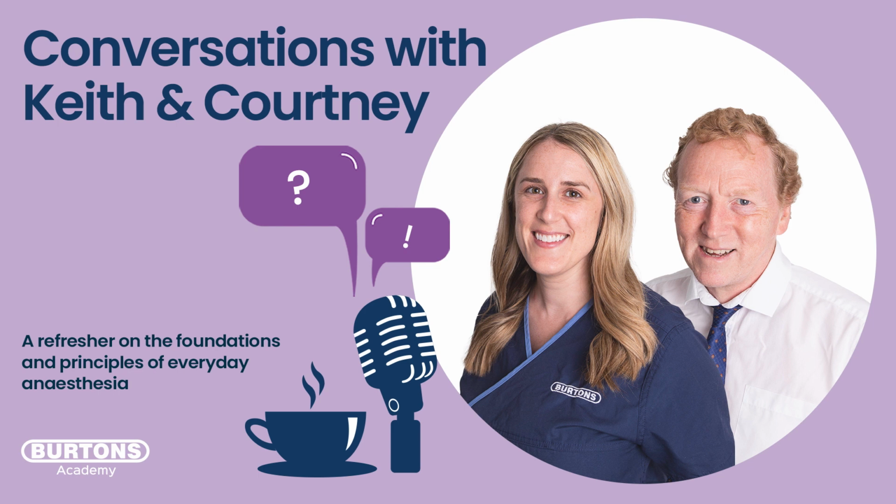So I'm going to go out on a little bit of a limb and put the figure of 10 out there, because I think 10 is a nice, easy number to remember. That 10 is 10 centimeters of water pressure. Okay. So what I'm going to say is, if you don't really know what to expect, and it's not a tiny mouse, and it's not a horse, then aim for 10. And then from that point, we'll make some adjustments. But if you aim for 10, you're not going to go far wrong. You're certainly not going to do any damage. You may underventilate some, but you're not going to do any damage. So that's a nice starting point, 10.